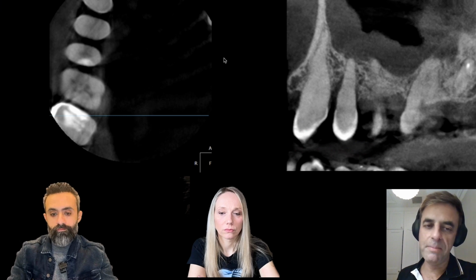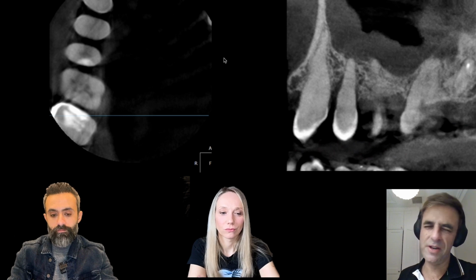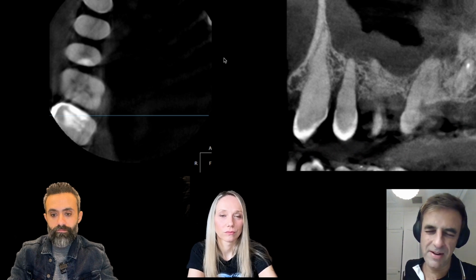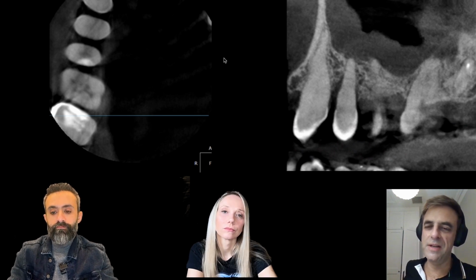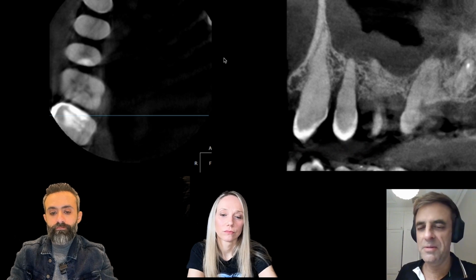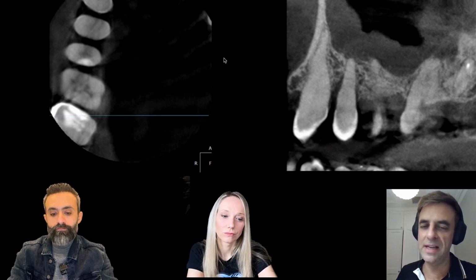The problem is, when you try and probe the patient, you can't probe in the mesial and distal regions of this patient easily. That's obviously uncomfortable. And even if you've got a pocket of 3 to 4 millimeters, you wouldn't necessarily suspect a crack, the patient is in their 70s and they might have some periodontal disease. It's a really difficult decision to make. Unless the crack was very isolated and deeper than that, you would probably not investigate this. But with a CBCT scan, you can see there are these V defects in the bone.